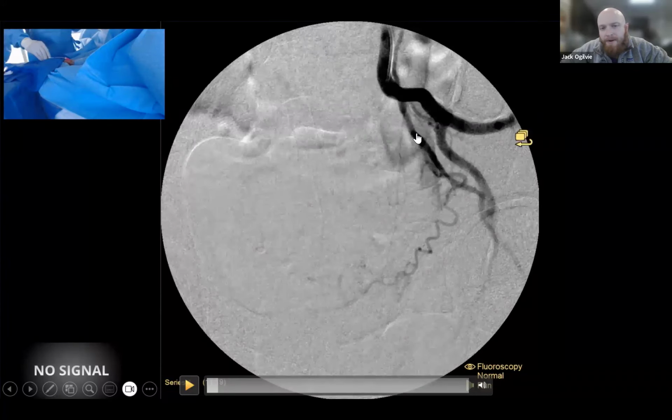And so I'm looking for a specific artery, which is this kind of real curvy one here, but we can pretty reliably find this artery that goes to the prostate and then get into that and block it off from the inside.